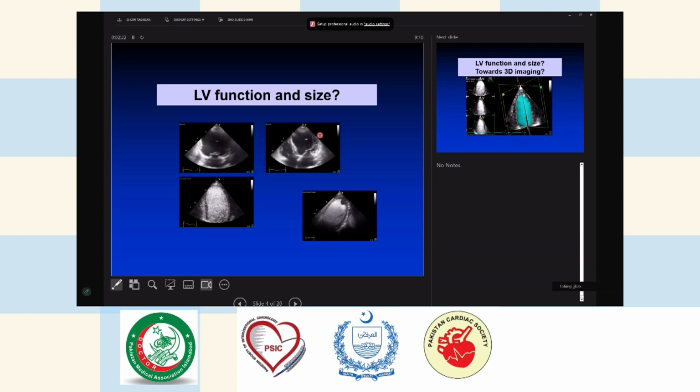If you see a big heart like this, your question is immediately, does the patient have maybe LV thrombi? Most likely they have LV thrombi because this is all scar here and is not moving. But what you want to know is there's some thrombus where I need to think of some procedure, because if it's really moving in the left ventricle, you need to think about some treatment.